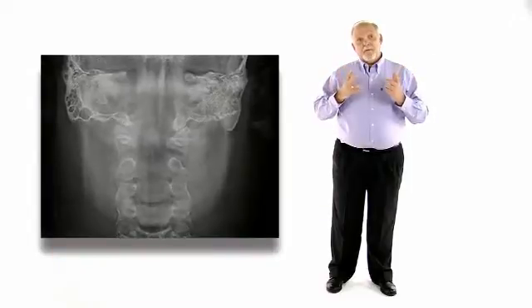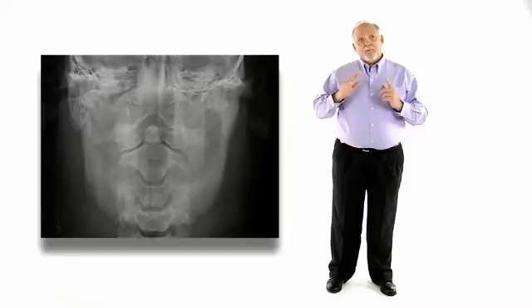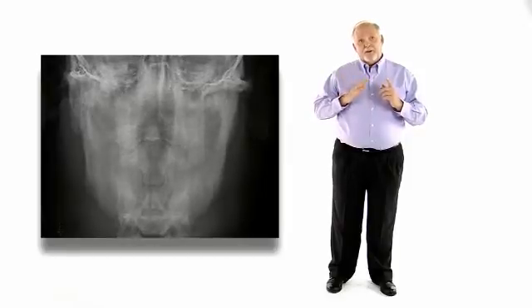If the spine imaging could not be cleared through general radiography, the patient would have to be transported four hours via ambulance to the nearest trauma hospital that had access to CT. A technologist recommended performing a volume rad radiographic study to help determine exactly what the black line was on the odontoid image.